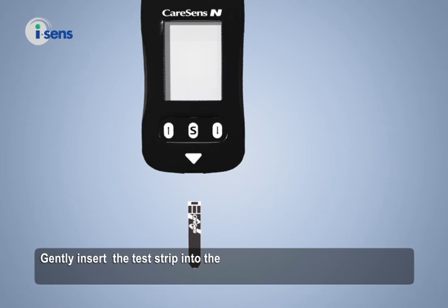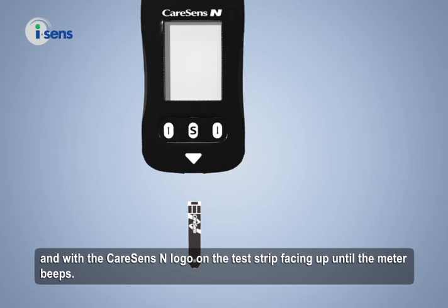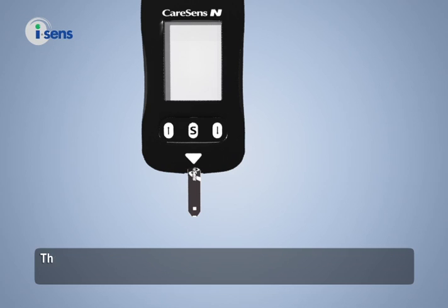Gently insert the test strip into the meter, in line with the triangle symbol on the meter and with the CareSense N logo on the test strip facing up, until the meter beeps. The meter will display the blood insertion symbol.